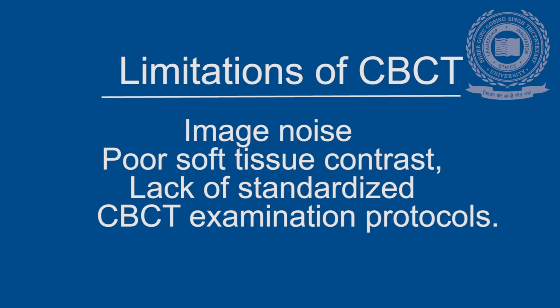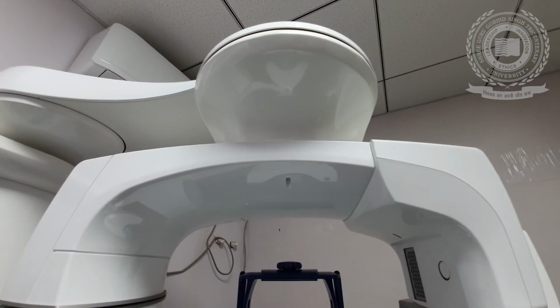Limitations of CBCT include image noise and poor soft tissue contrast and lack of standardized CBCT examination protocols.